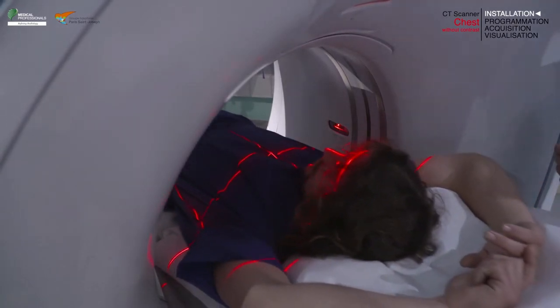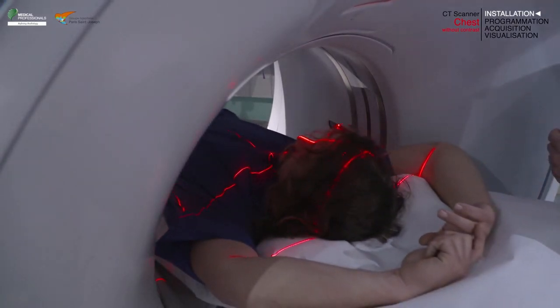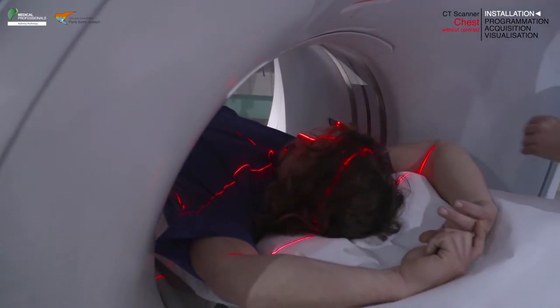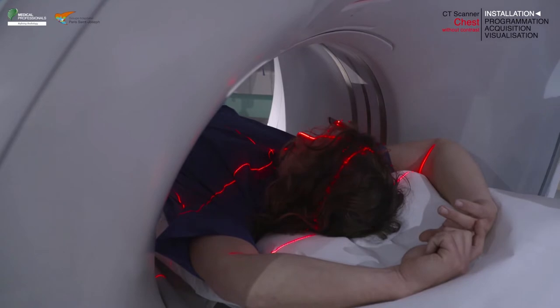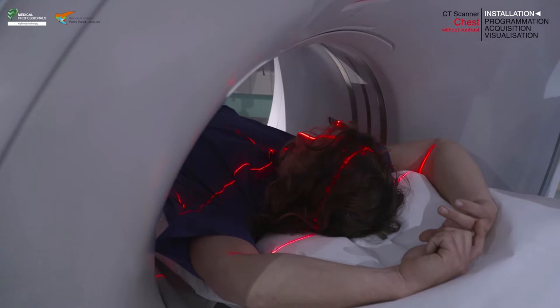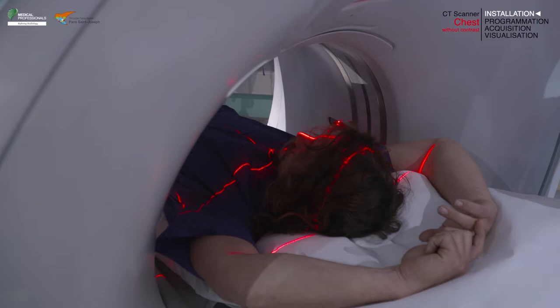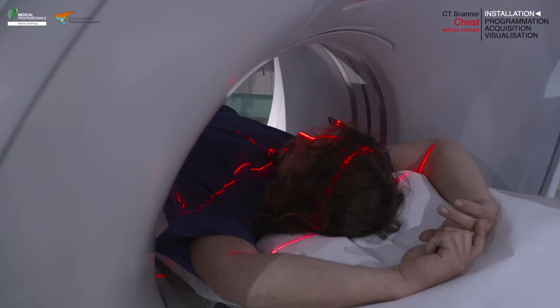Align the laser light to the jugular notch of the manubrium using the internal axial laser light. Make sure that the lateral laser light is set at the mid-axillary line of the chest and that the longitudinal laser light is placed on the median sagittal plane.